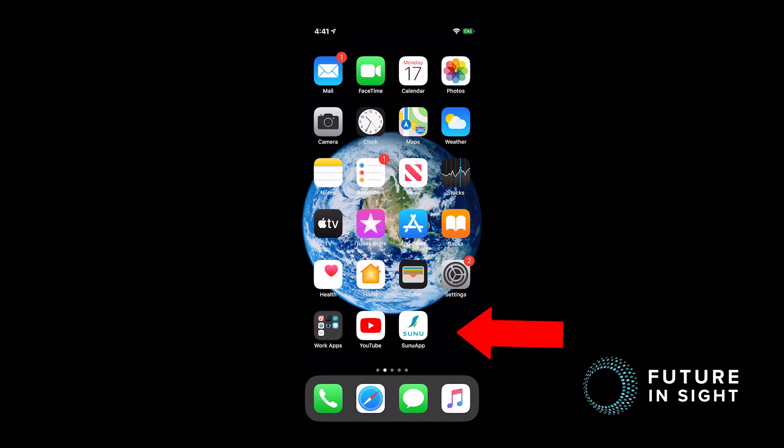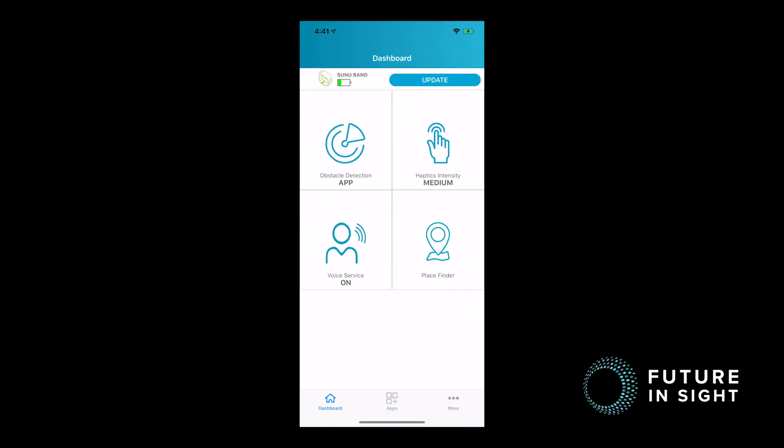The Sunuband app is available both for iPhone and Android and is a free download. To access the app after you download it, you tap on it and the first screen you will be brought to is the dashboard. On the dashboard you have some very helpful areas, including seeing how much battery life is left on the Sunuband, if there are any updates you can do, and different ways of changing the settings of the Sunuband to make it fit the client's needs.